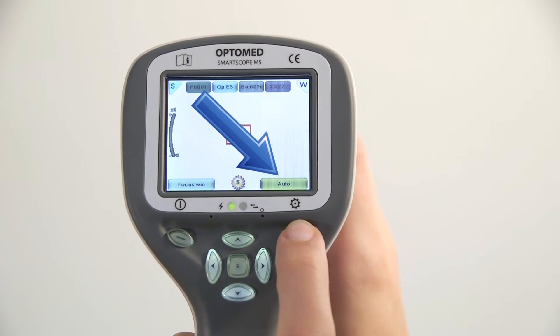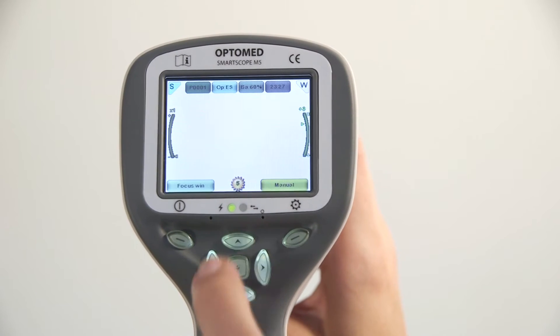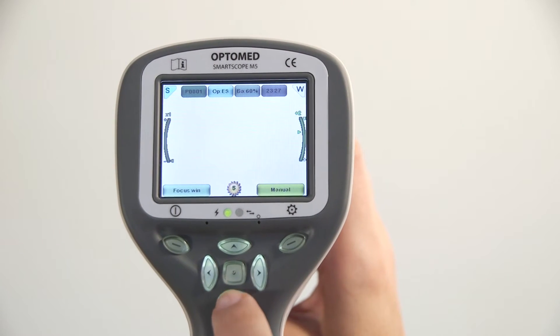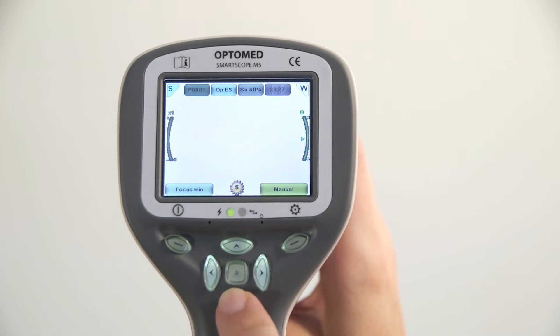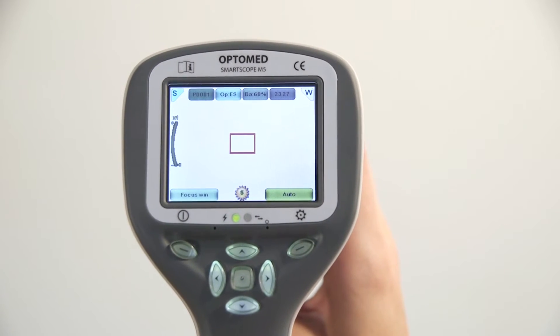Select preferred focus mode by short pressing the right soft key. In manual focus mode, use the up and down arrow keys to adjust the focus. It is recommended to use autofocus to achieve the best quality images.